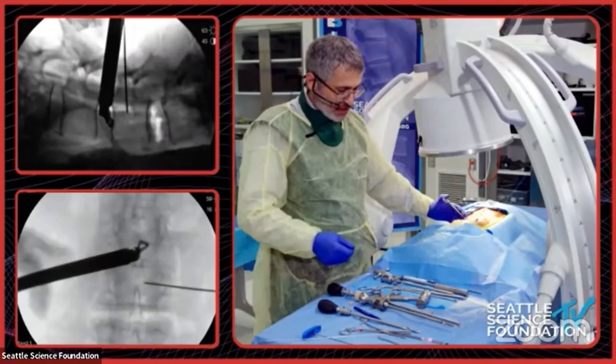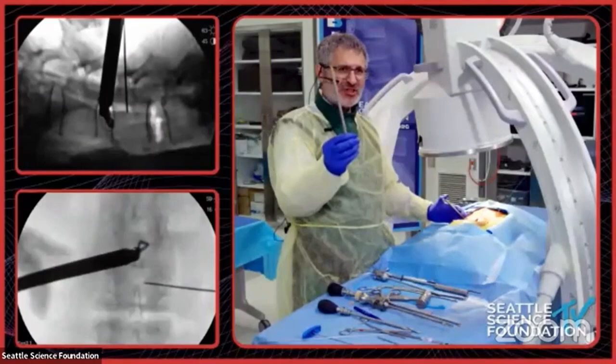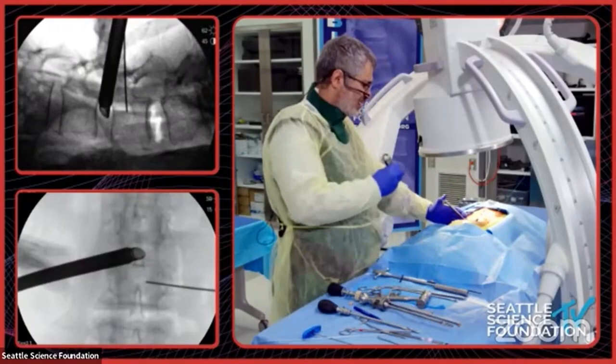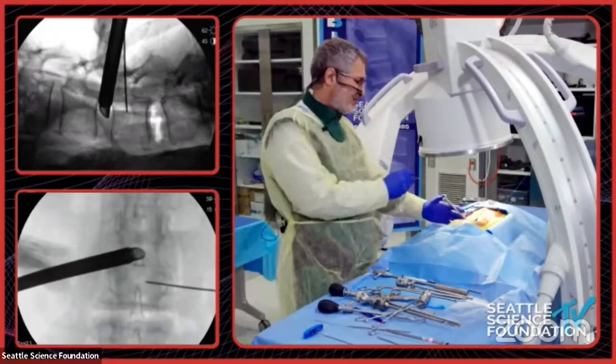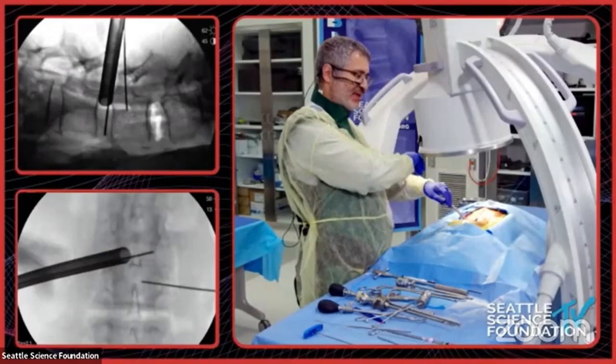Then I finish up with more action of the pituitary. At this point, my tricalcium phosphate is soaked with bone marrow for three to five minutes. It is in a directional tube — I can put it down, to the other side, or toward either of the end plates, in whatever direction I want. I push my biologic in. Then a K-wire goes back in — I push the dull end of the K-wire in. Because I have tricalcium phosphate, it gets literally locked in and stays quite well. Then the tube comes out.